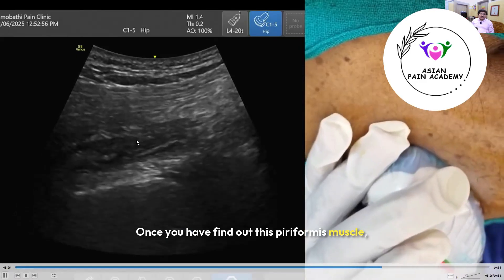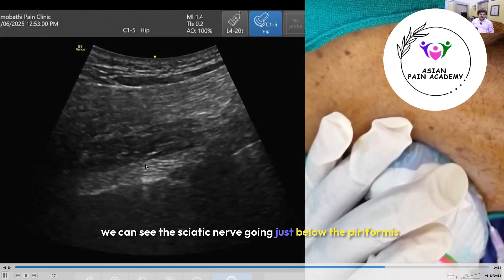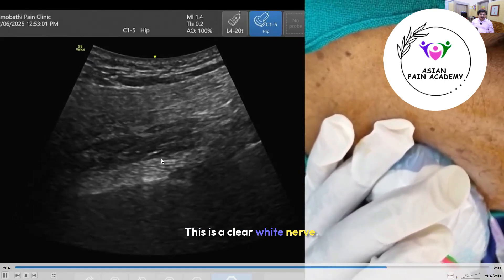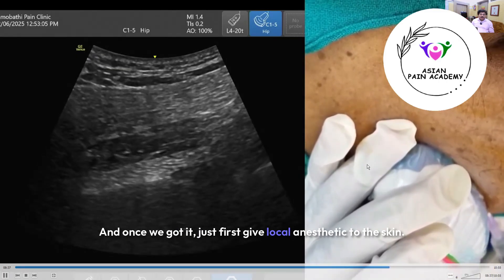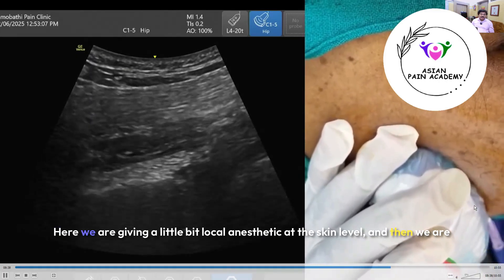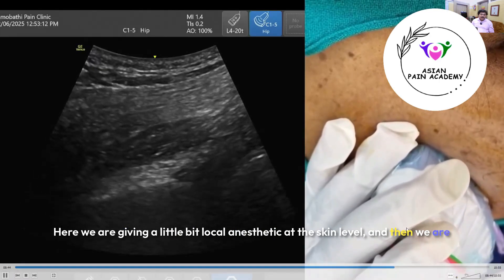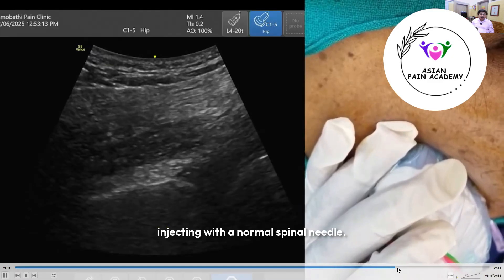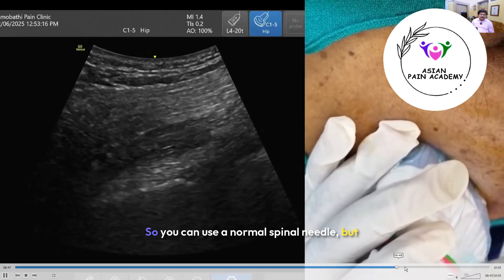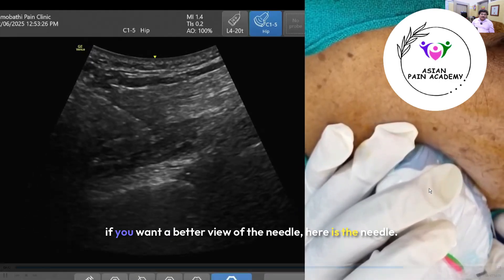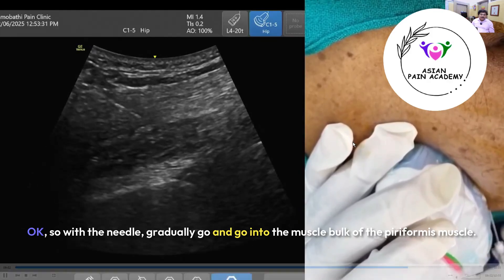Once you have identified the piriformis muscle, you can see the sciatic nerve running just below it — this appears as a clear white structure. Once located, first give local anesthetic to the skin. Here we are administering a small amount of local anesthetic at the skin level, and then we inject with a normal spinal needle. You can also use an echogenic needle if you want a better view of the needle tip.